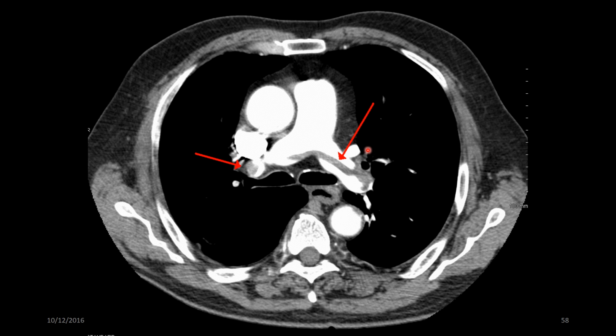And it's essentially a blood clot that breaks off, because a DVT can remain localized and stay in your leg, and you can give clot-busting drugs to get rid of that or treat that using something called new and novel anticoagulants. And what happens is sometimes it can break off and form a clot in your lungs, and the two red arrows here are pointing to a very big pulmonary embolus. It breaks off and lodges in your lungs, and it blocks the blood supply to your lungs. So this is your pulmonary artery, and it splits off into your left and right pulmonary arteries. And this here was what we would call a filling defect or a pulmonary embolus that extends between both the left and right pulmonary arteries.